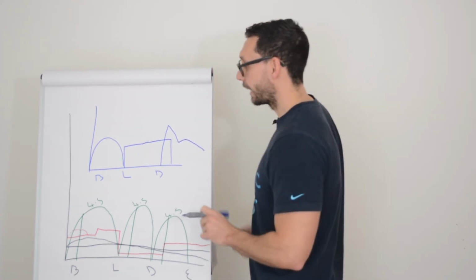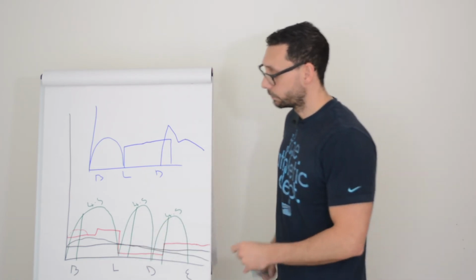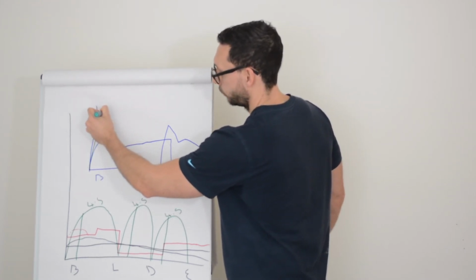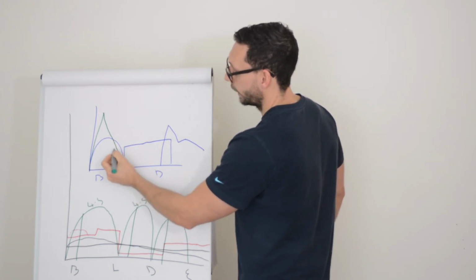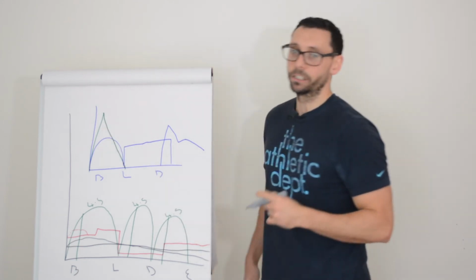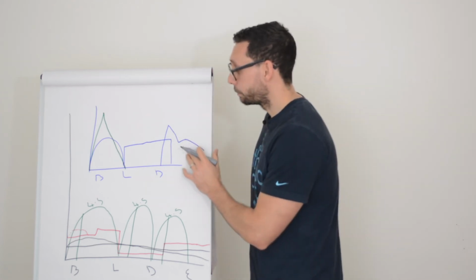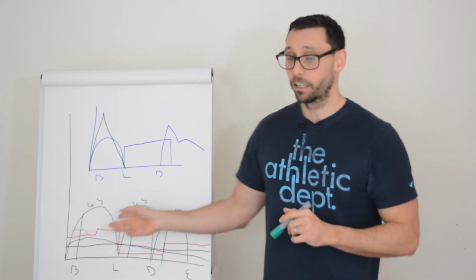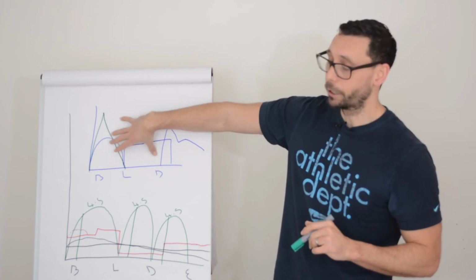We can also stack more insulin at the beginning of the dose. So we actually borrow some insulin from our background insulin. So you turn off your background insulin essentially with something called a super bolus. So you get a big rise in your rapid insulin, and then it dies back off. And after about 2 hours, your basal insulin returns to normal. So this is for those very quick releasing meals that might get into your system quite quickly. So again, it gives you much more flexibility with your pump compared to how you might be managing just using subcutaneous injection therapy. So you can change both how your basal and your rapid insulin or your bolus insulin is delivered.